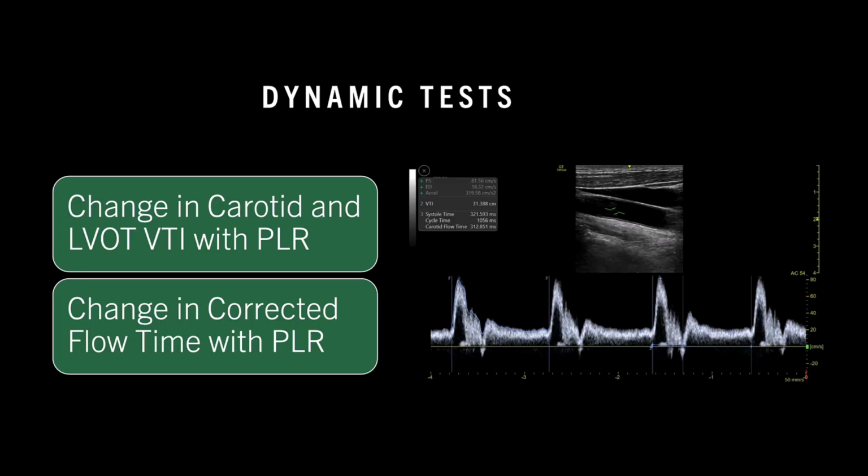Carotid and LVOT VTI with a passive leg raise, and assessing change in the corrected flow time with passive leg raise. And we're going to show how adding in a passive leg raise with these measurements helps us determine whether stroke volume is going to increase with preload, which defines fluid responsiveness.